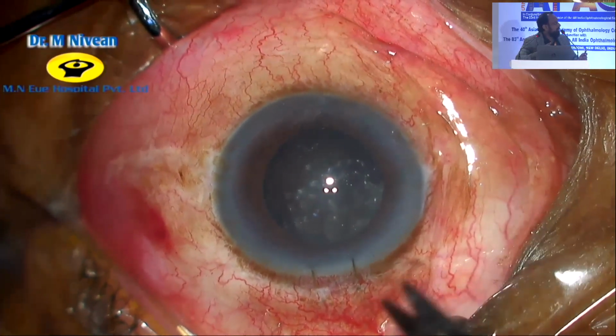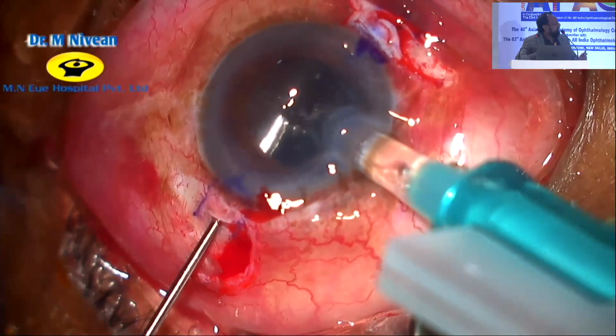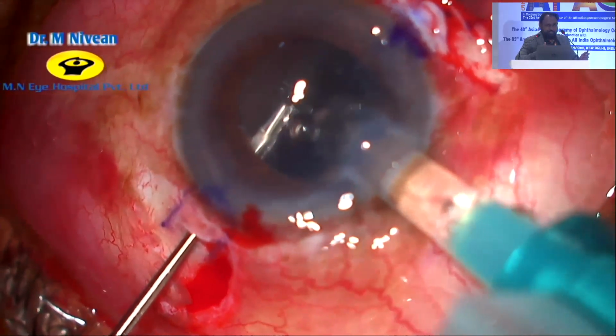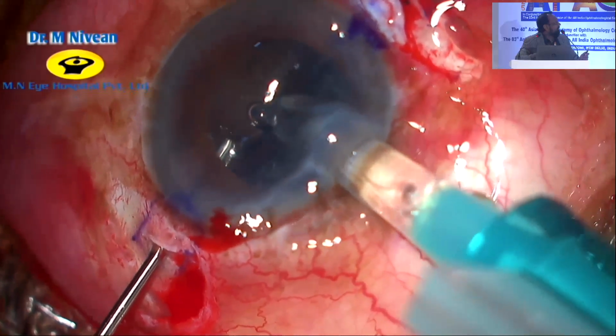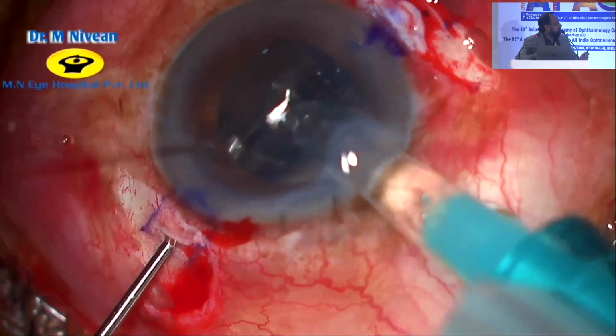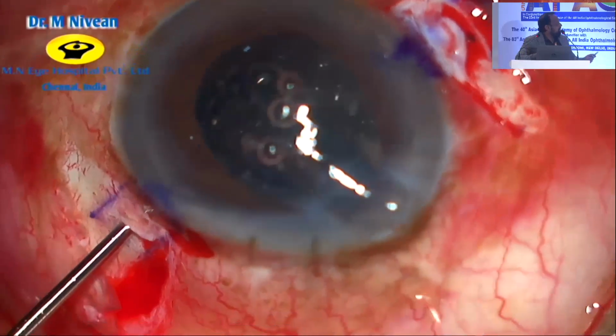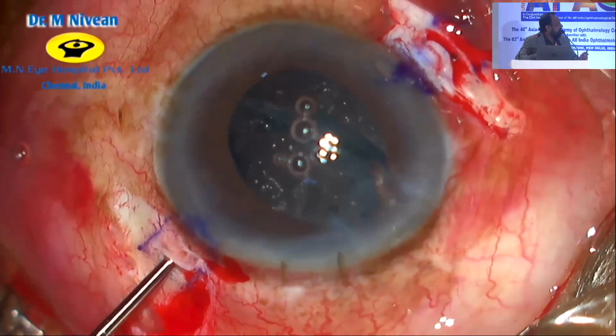We know that sometimes the bags are weak. So here we're just doing it through the anterior approach. So ideally you should have used an AC maintainer. But again, because it was formed and I didn't use a lot of viscoelastics. So again, here we're just making the grooves. We didn't make the full flaps. So there are just various modifications of the same technique.